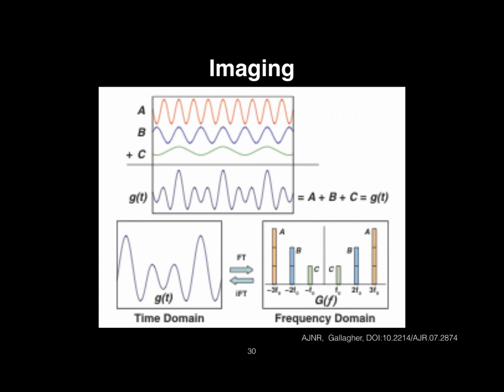It says if you have any arbitrary shape, image, signal, you can take anything arbitrary or random, and if you have enough terms that vary regularly, the most common sets are sines and cosines, so things that vary periodically, like that RF waveform showing in some earlier videos, or even these waveforms here.